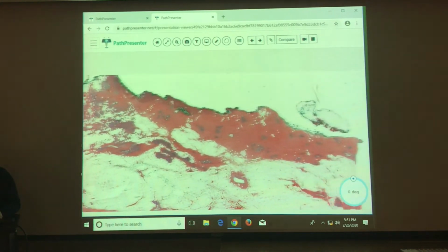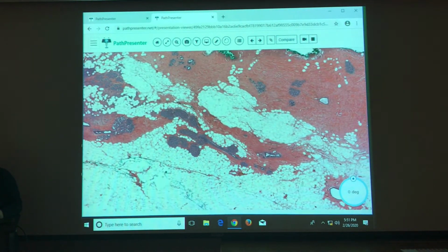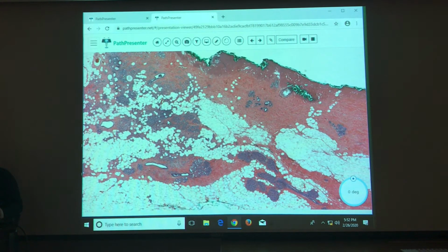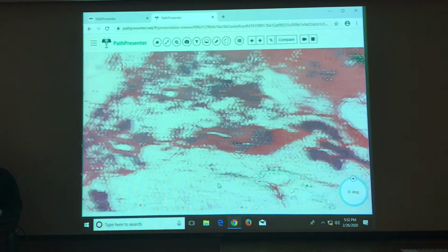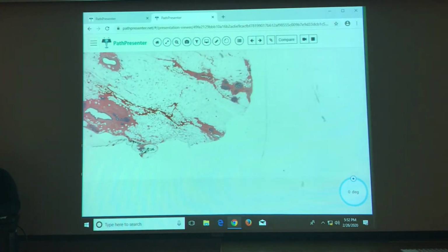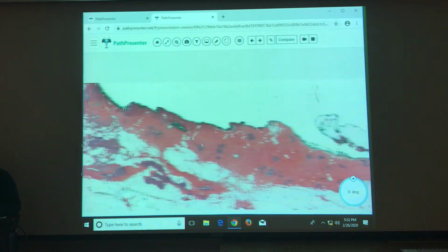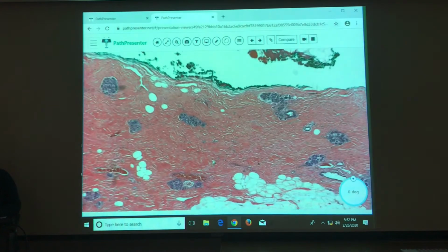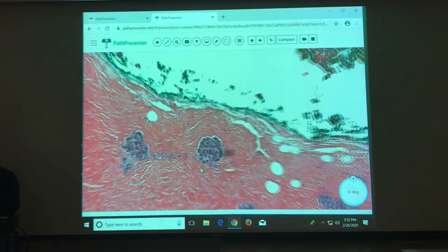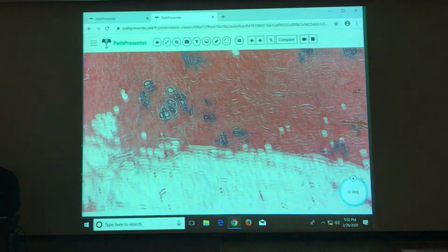We have breast tissue here. There are some lobules. There's an area that could be just lymphocytes, or if it's 2 lobules, it's going to look really weird. We'll see once we zoom in on it. But first, just a quick overview of the entire slide. We have fatty tissue, fibrotic, more fibrostroma, and we're going to take a look at some of these more benign looking glands. They're in nice little units there. Doesn't look too concerning.